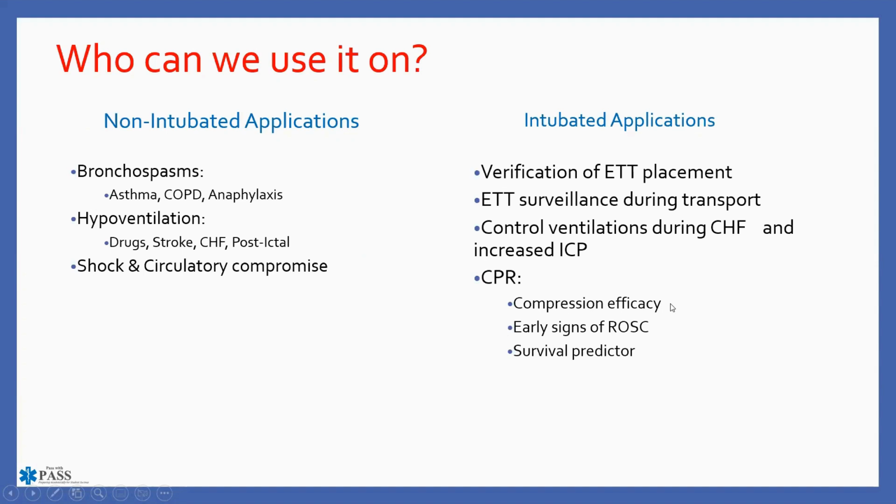Compression efficacy, if that end-tidal CO2 is showing that your numbers are less than 10, we need to make sure that we are either A, switching out with somebody that is not tired, or B, putting them on a mechanical type of device. So with your mechanical devices, either your Zoll Autopulse or your Lucas device, if you're using physio, it doesn't really matter. If you're using one of those types of devices, then you're probably going to get numbers that are much higher than 10. You're probably in the high teens to early or low 20s, something along those lines.